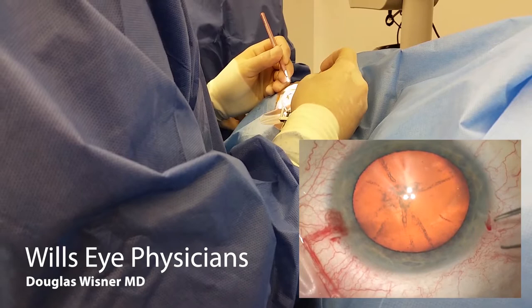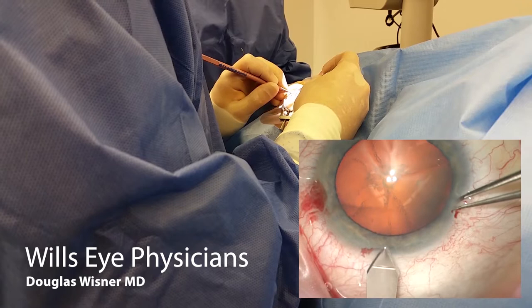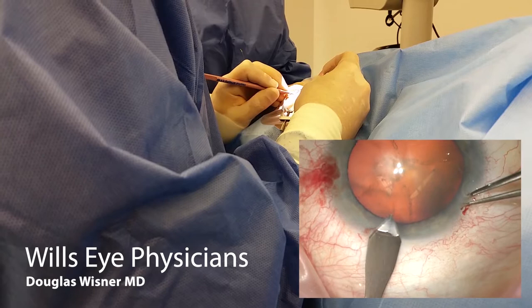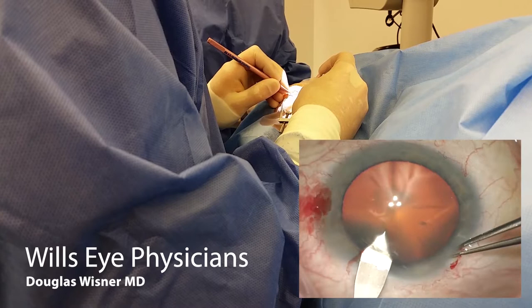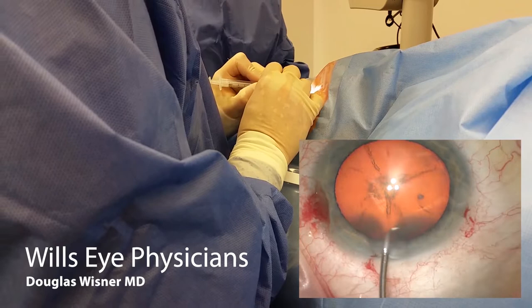Putting more viscoelastic in is only going to push more out of the eye. Here I am fixating with the paracentesis. I use a 2.4mm keratome creating a short partial thickness incision to create an entry point for my keratome. This gives a smooth flap in the cornea. Then I'm progressing, angling up into the cornea and then down towards the center of the lens. In essence, with one instrument, I created a true triplanar wound that seals quite nicely.